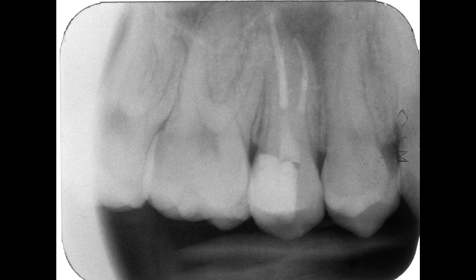Now one can discuss if there is a need to crown that tooth. I would go for a crown, and that was my recommendation to the referrer. If this is already done, I can't say. Often you send the patients back, and it is difficult to get them back into the office for a recall, as you know.